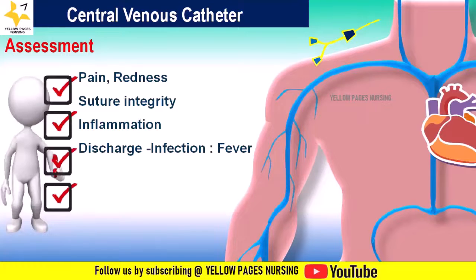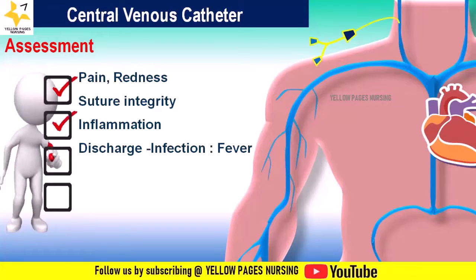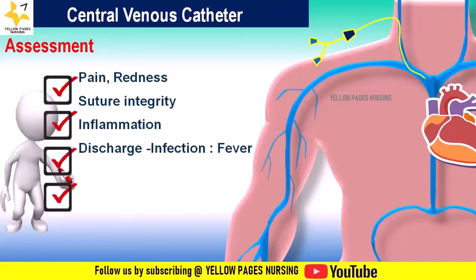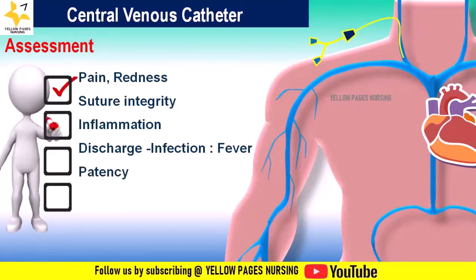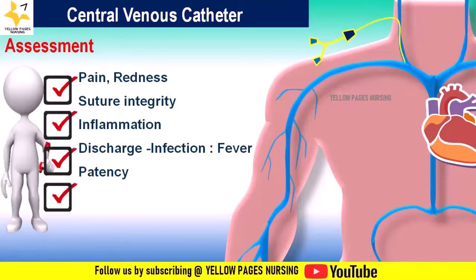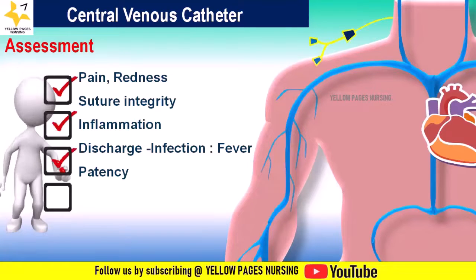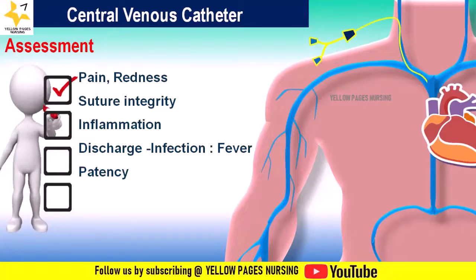Infection mainly occurs at the insertion site if it is not cleaned and disinfected properly, which may lead to bacterial contamination. And next is assessment of patency. Patency refers to the unobstructed flow of fluids through the central venous catheter. Patency is monitored periodically to ensure the unobstructed functioning of the central venous catheter in order to administer fluids, medications, or for other treatments.